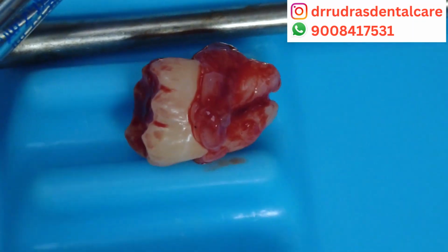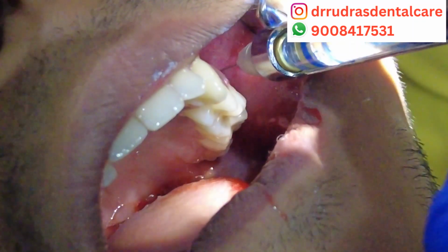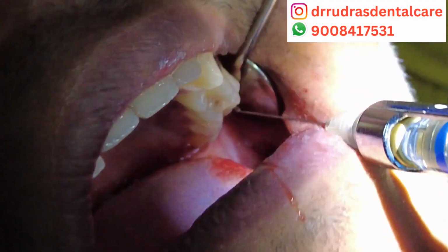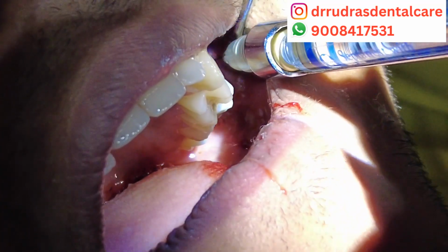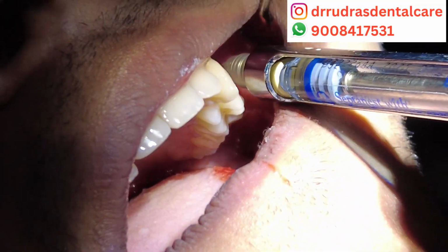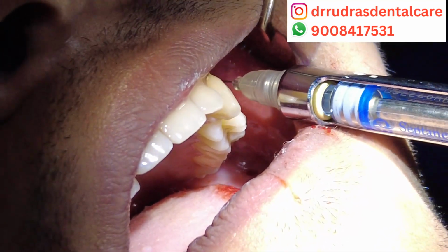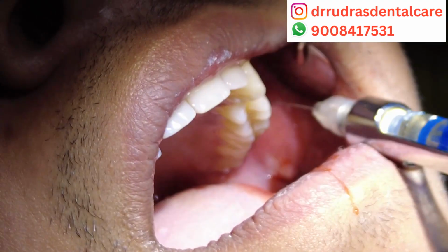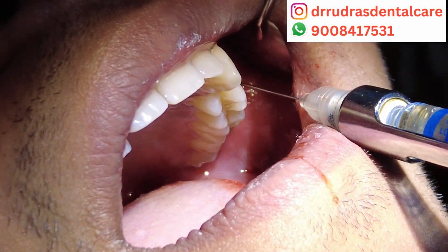Coming to tooth number 2/8, that was the upper tooth which was causing the cheek bite as well. As per the discussion with the oral surgeon, he said it was always better to take both the teeth out because they are vestigial organs, so to say. And we are giving the posterior superior alveolar nerve block along with local infiltrations. We also gave the greater palatine nerve block, which we did not record in the camera, but yes, we have given it.